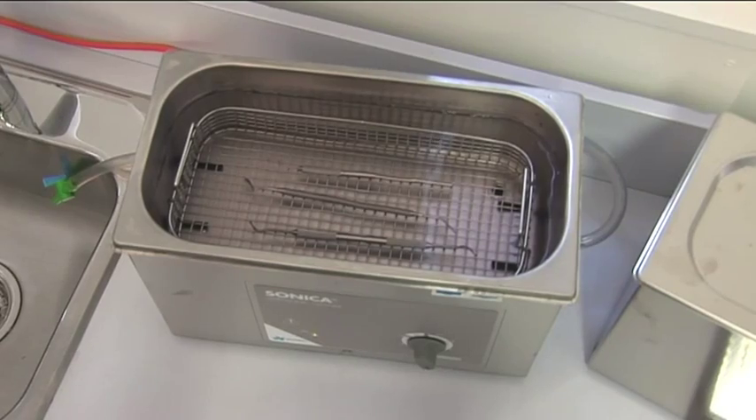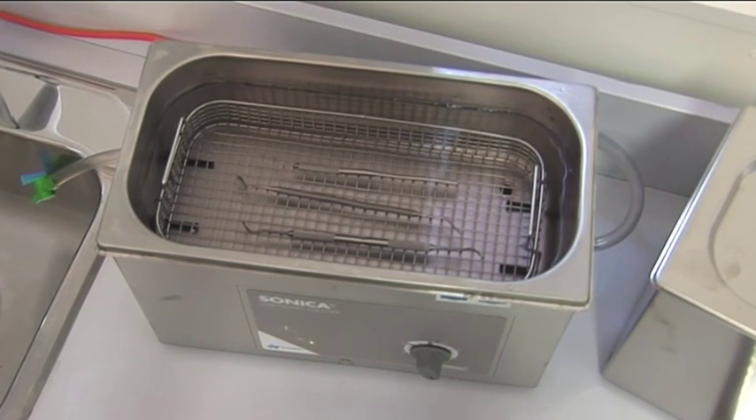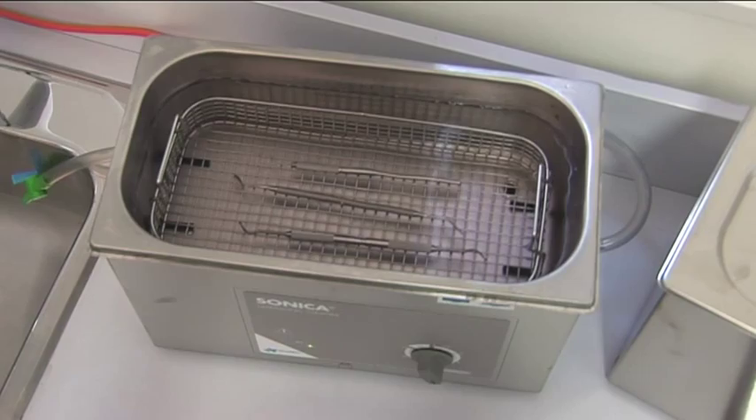Each crystal oscillator is individually tuned to the one-piece stainless steel tank, which reduces heat and noise while maximising cleaning power.